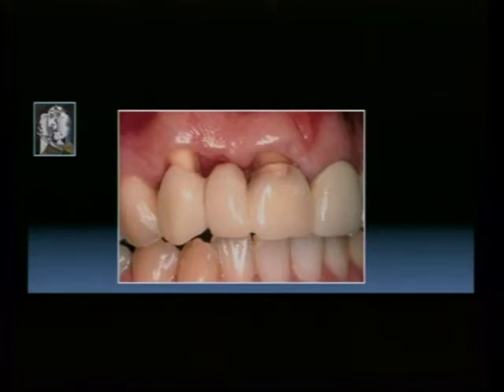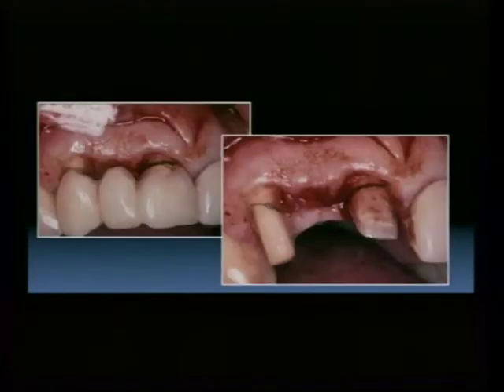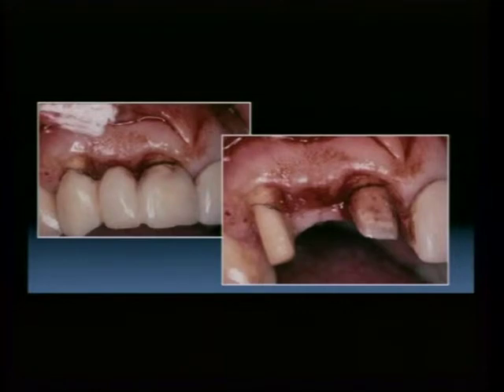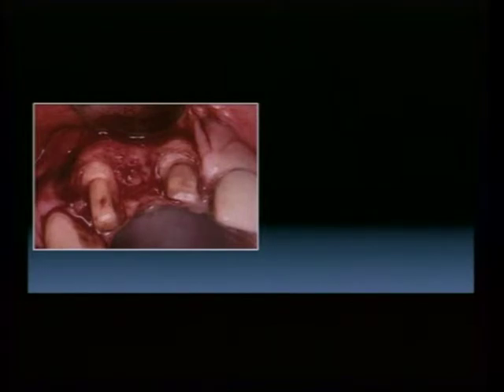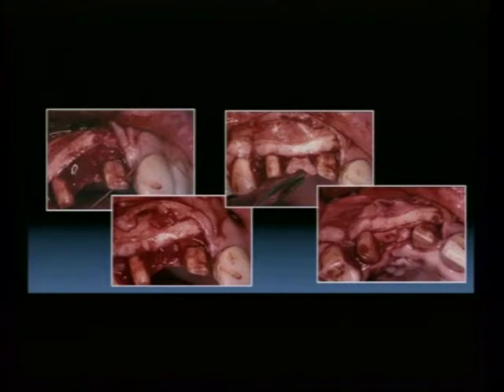A case here where the restorative dentists had advised extraction of the canine because they didn't believe root coverage was a good indication. You'll see that by marking the pre-existing restorative margins, recontouring those once a surgical flap is laid, placing a connective tissue graft, and an interpositional graft.